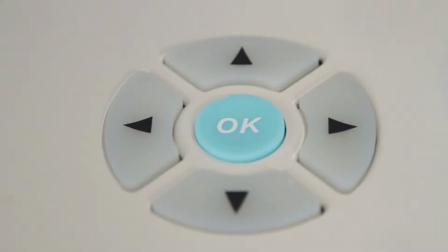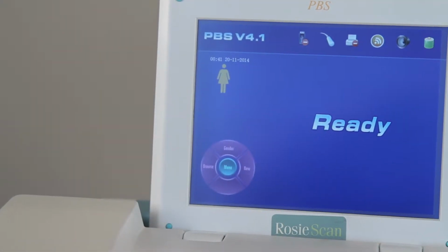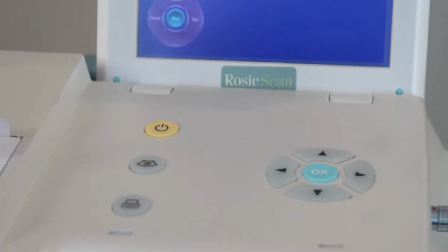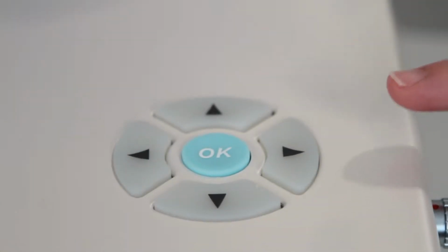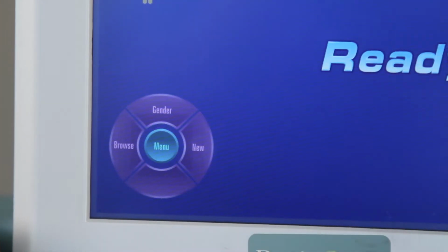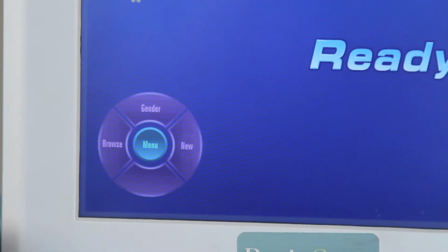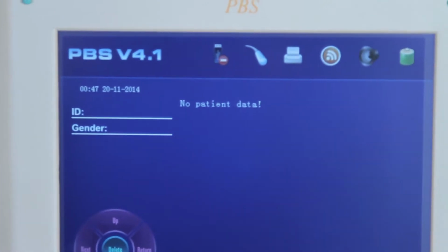You will find 2 sets of navigation keys, one set on the Ready screen called Functional Keys and one set on the control panel called Directional Keys. Press the right directional key or touch the New Functional Key on the Ready screen to delete the max tested volume without switching off the device. Press the left directional key or touch the Browse Functional Key to browse previously saved readings.